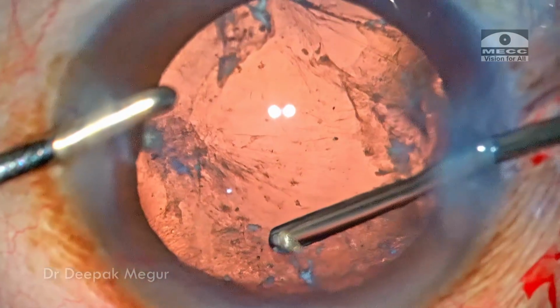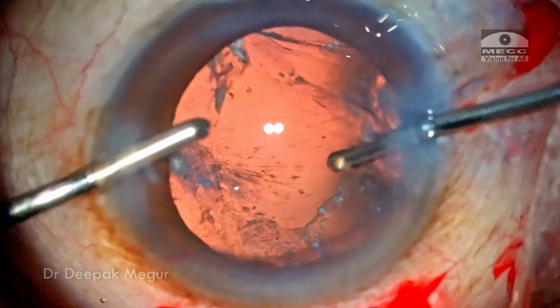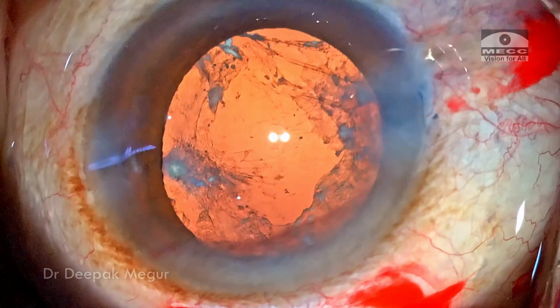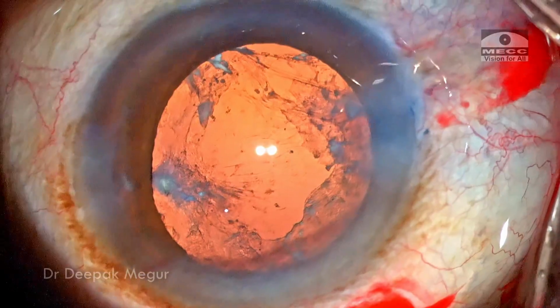Since we don't have an intact rhexis all around, the plan is to just place a multi-piece lens in the sulcus over the anterior capsule and the underlying posterior capsule support. Although the centration might not be great, still that is the best option which we have.